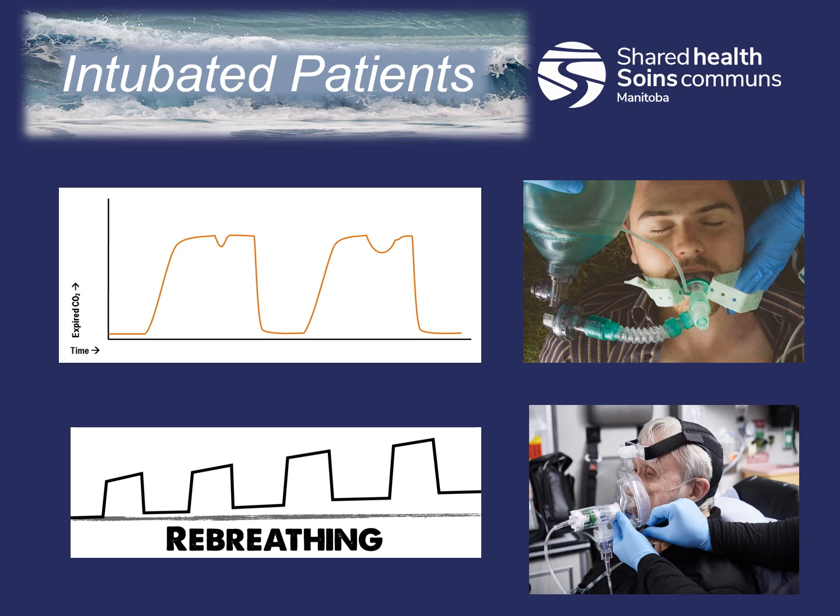If seen, ensure that the breathing circuits are not malfunctioning. This includes operator error of the BVM and ensuring that the patient has time for a full exhalation. Slow down the respirations. CPAP settings may need to be adjusted when rebreathing occurs, and adjust the PEEP or the oxygen flow.